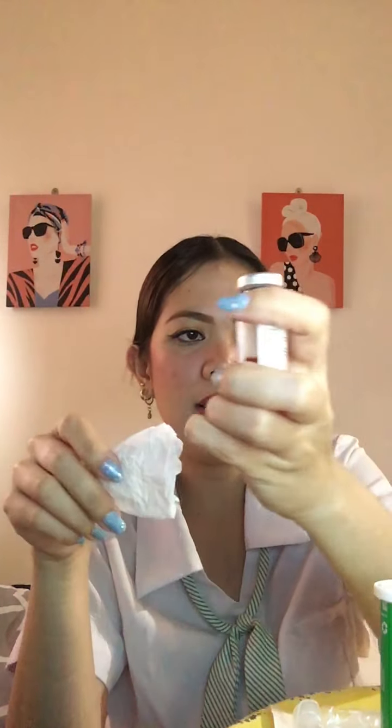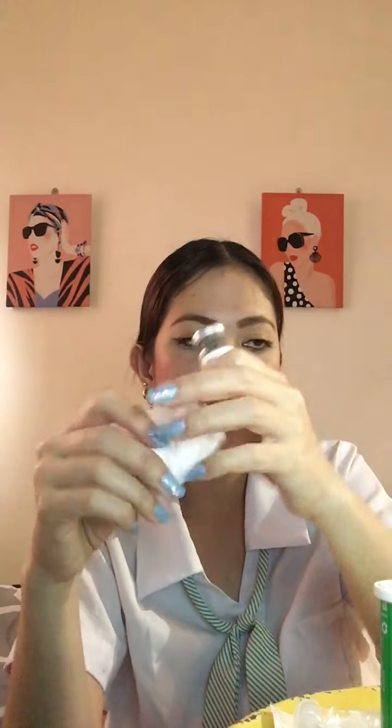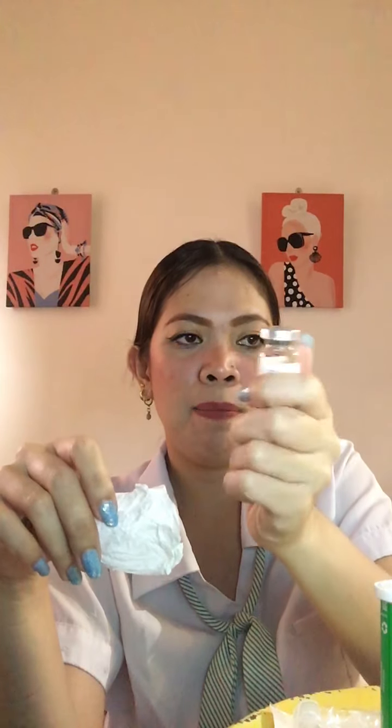So third is to place a piece of sterile gauze between your thumb and the ampule neck.